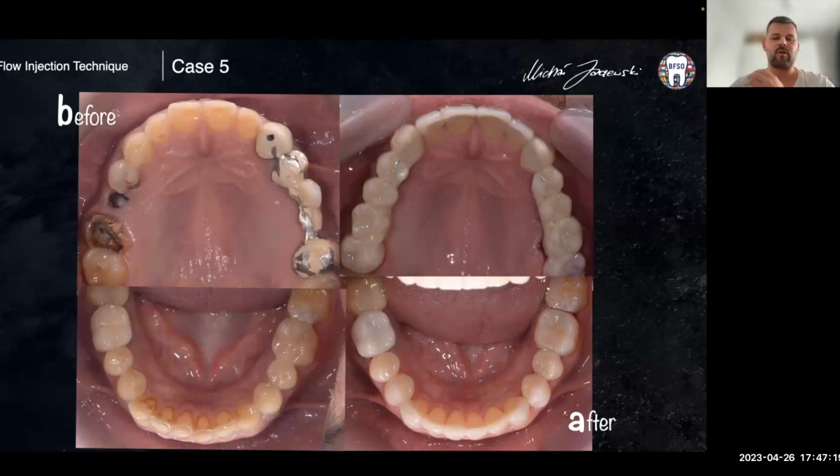So the patient, of course, has other treatment like implant treatment, but we need the time. So we can use this time for temporary restoration, and the patient can check how it will work, how it will function in the mouth, how it will be eating during this whole process when waiting for the implant integration.